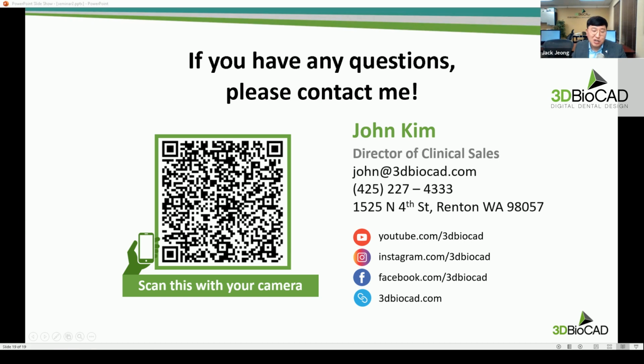If we need to discuss in more detail, I do a TeamViewer session with my doctor to do live planning together. So I always want to get the doctor's sign-off or approval, and then I produce the surgical guide. That's what I'm doing as a lab tech.